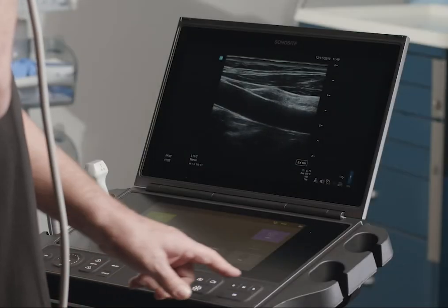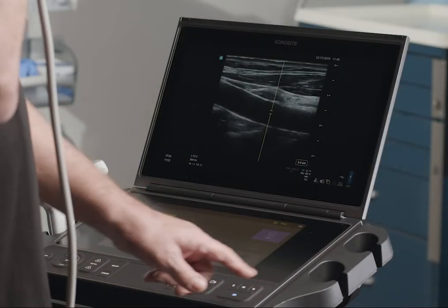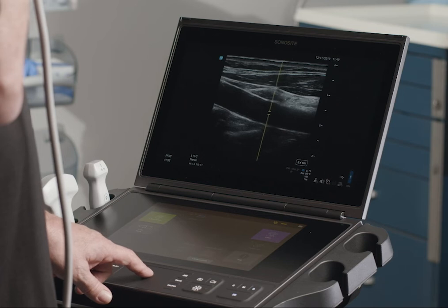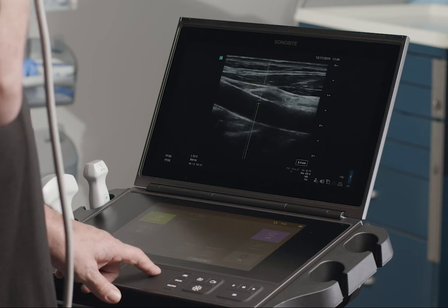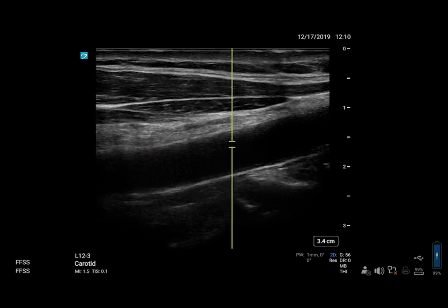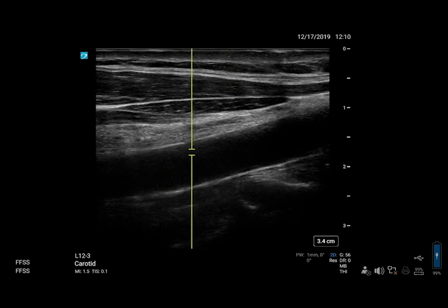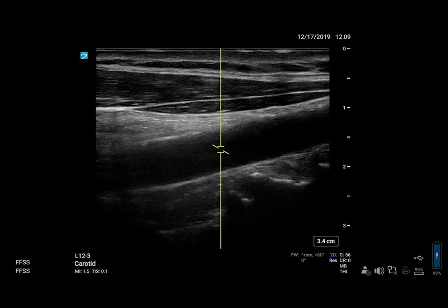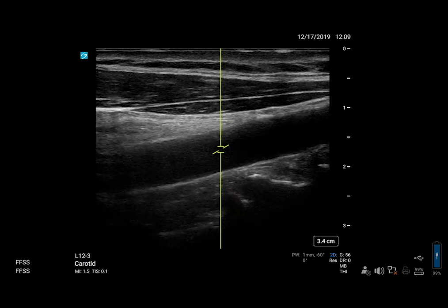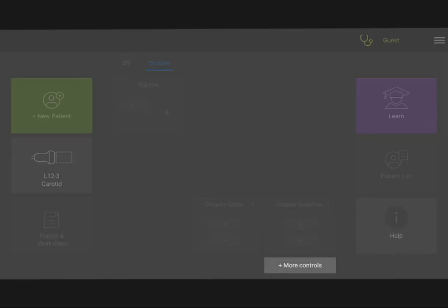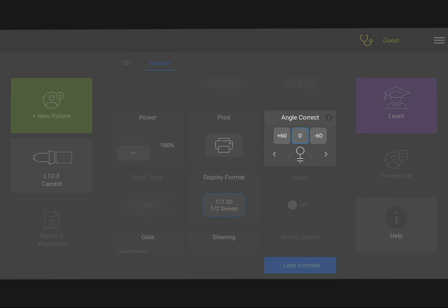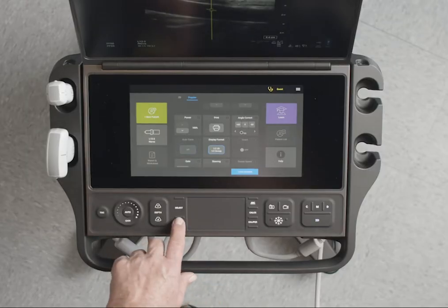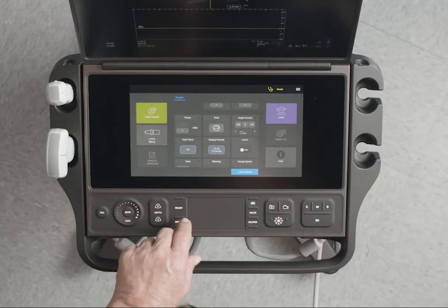Use the touchpad to position the D line and gate. Horizontal movements position the D line and vertical movements position the gate. To correct the angle of the gate, use the Angle Correct Control on the touch panel. You may need to tap the More Control button to find the control. Press the Update Control to activate Doppler.